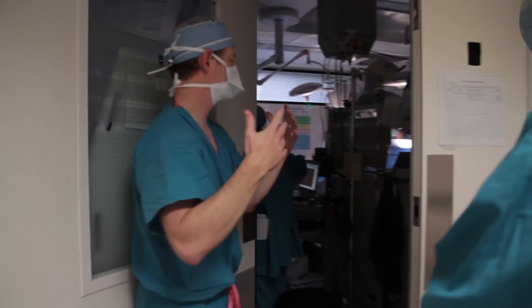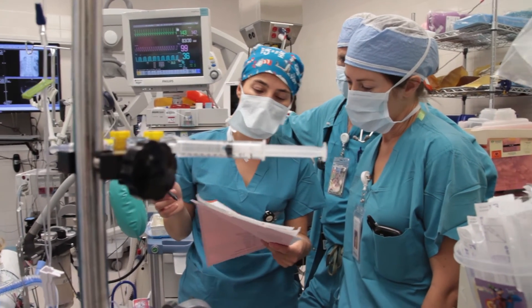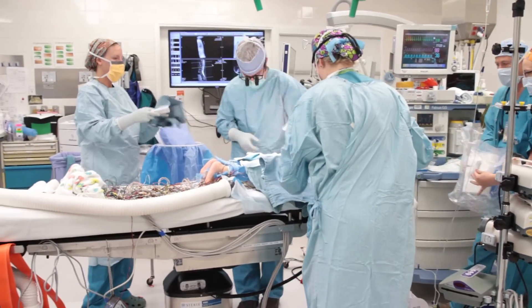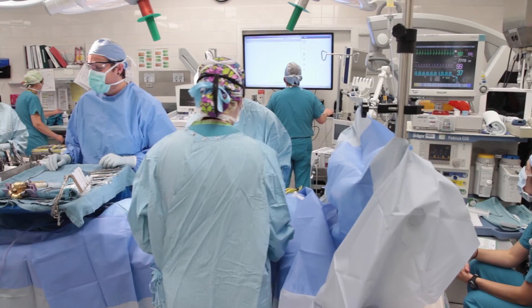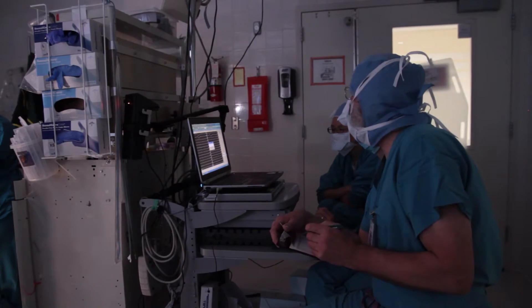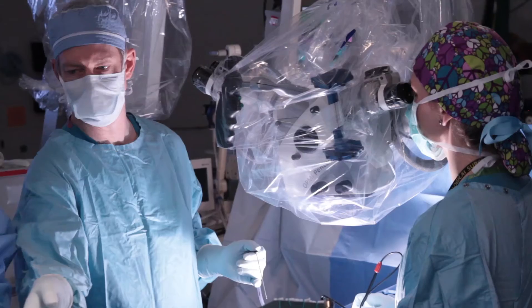In the procedure itself, it's a team effort. I'm one of many members of the team. There's a variety of people in the room — anesthesiologists who are managing the patient, nurses who are helping assist with the procedure, handing instruments. And we have a whole team that's part of the neurophysiology portion, connecting the patient up so that we can test spinal cord nerve function and nerve function throughout the case. We're having a back-and-forth discussion during the surgery between myself and the electrophysiologist.